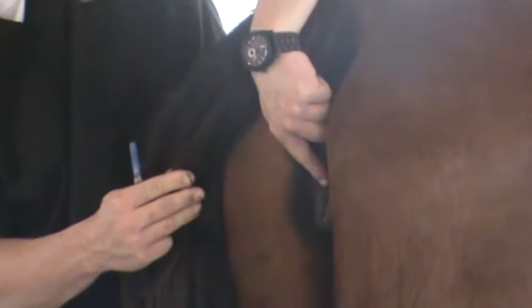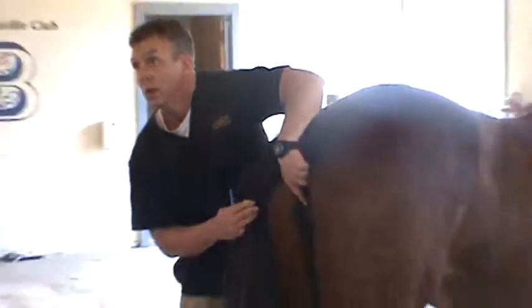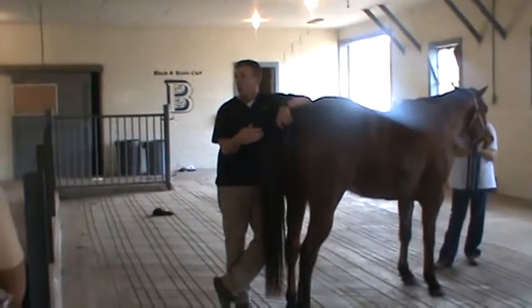Now, can you imagine that that would create any problems? What problems am I creating if I do that? Birth, if she wants to give a baby? Yeah, she cannot have a baby, okay? What else am I creating a problem with? Can I get my hand in there to go into the vaginal vault to inseminate her?